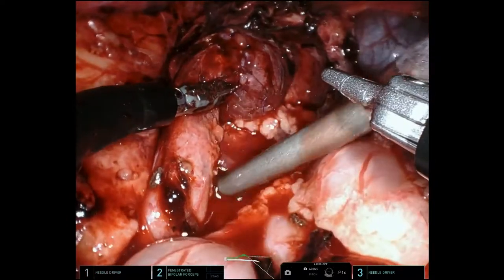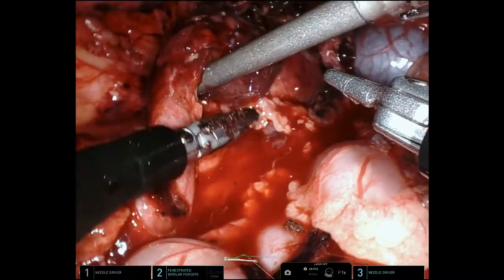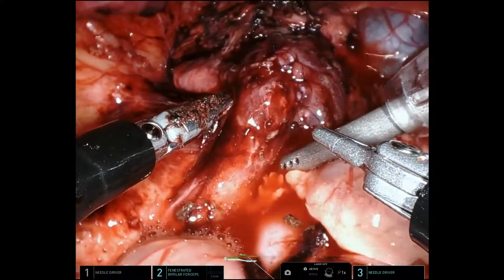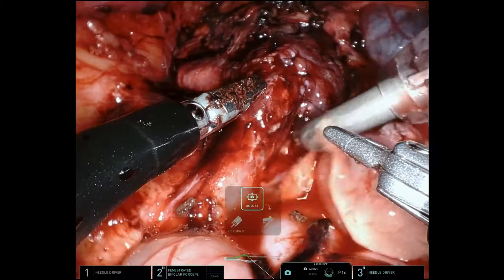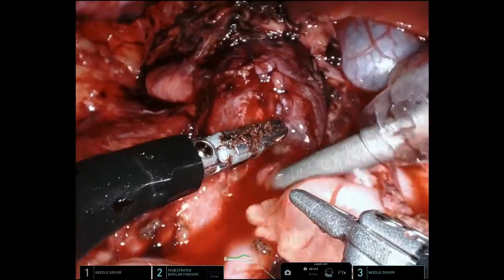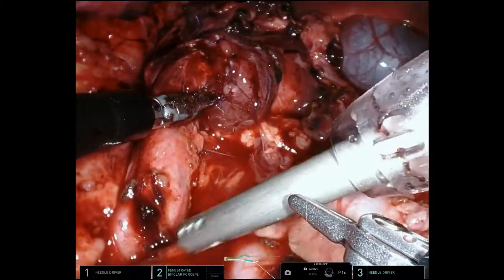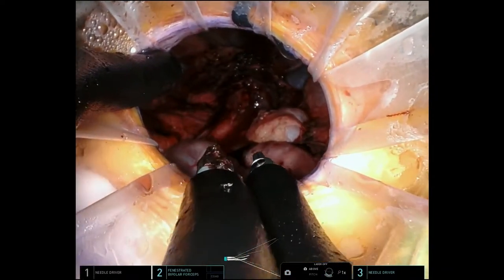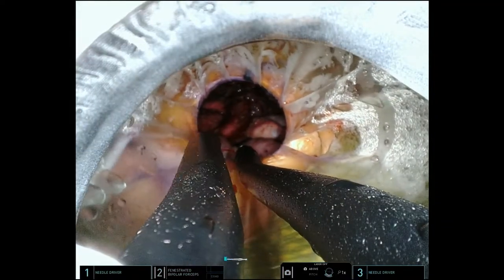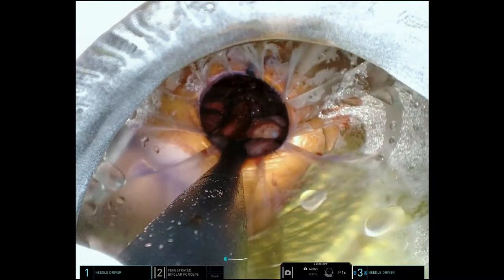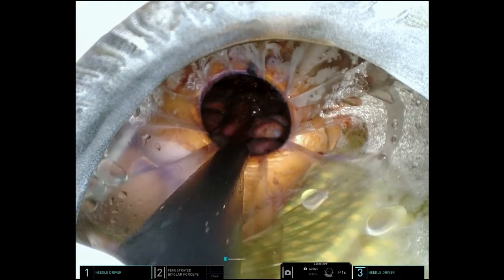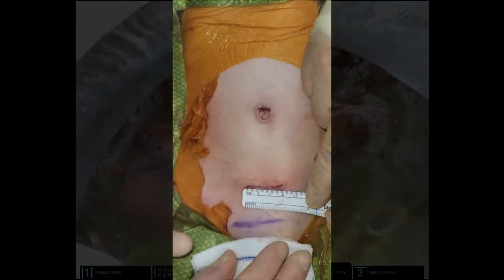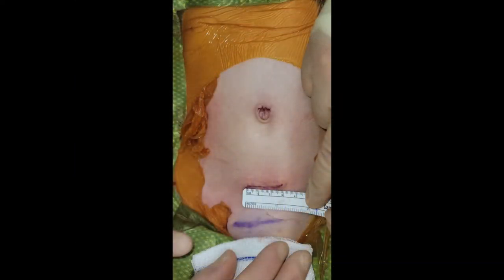You can see that the anastomosis is dependent, the renal pelvis and ureter have good color, the ureter is not twisted or kinked, it's not on tension, and it appears very medial — which are all characteristics that you want in a reconstructed ureteral pelvic junction. Finally, bringing the instruments back in, this is the cosmetic appearance of the incisions immediately after the procedure.